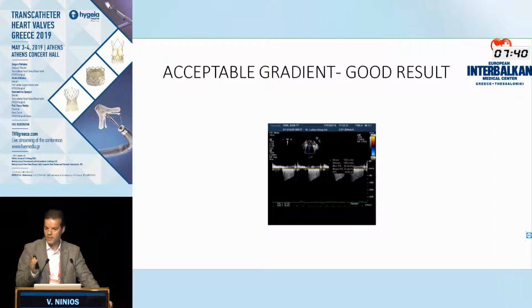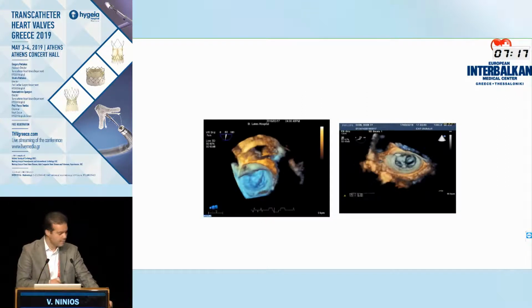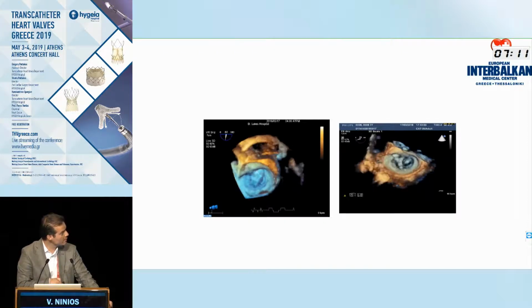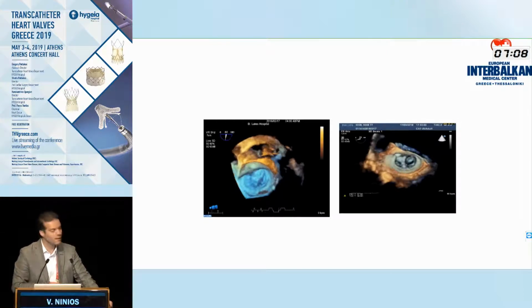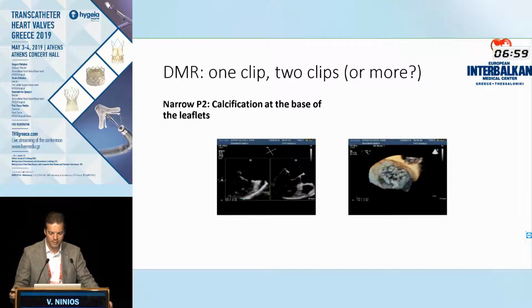So, you know, there's no easy way to predict this. You see a broad jet, you say, okay, I'm going to put 2 clips because we need 2 clips. You put 1 clip and you have stenosis, so you have to deal with that. And sometimes you have to look at the commissures, because when you put a clip in the middle, the opening of the valve relies on the commissures, and that's sometimes very difficult to see up front. This is exactly this patient. You can see this medial commissure is opening, the lateral commissure not that well. So this is a clip that was put towards the lateral commissure, leaving the medial commissure relatively free to open with an acceptable result. Now, when it comes to degenerative mitral regurgitation, it becomes even more complicated.